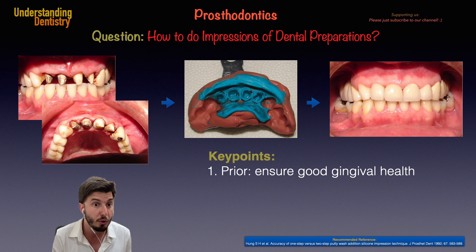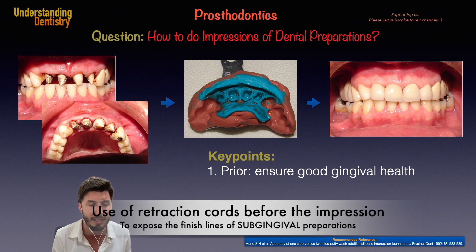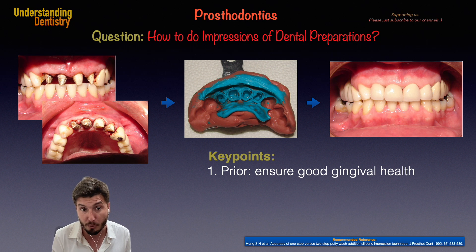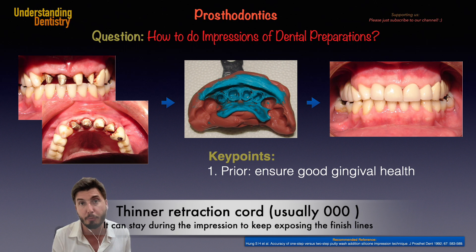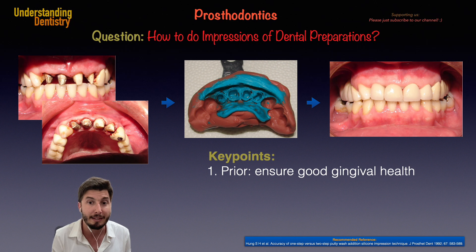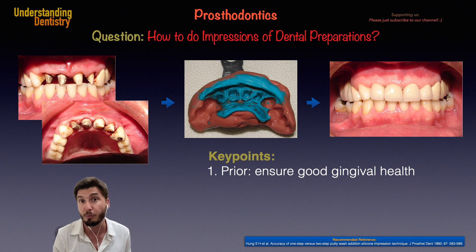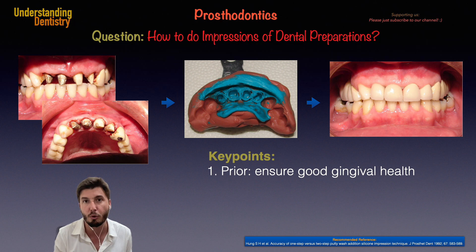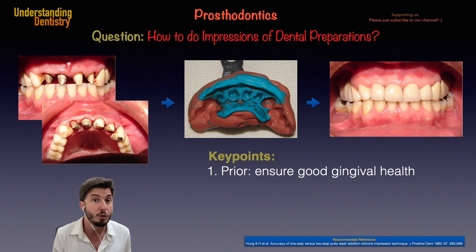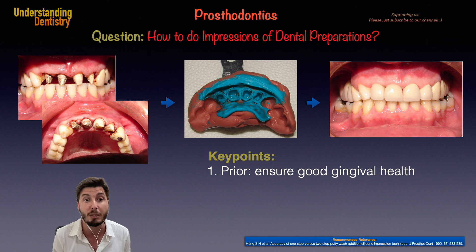We can also use other options to expose the border of the preparation. In this case, we use the two-cord technique. One cord stays exposing the border — the finish line of the preparation — and the other one, which is thicker, we remove before the impression. So the most superficial cord is removed, and only the deeper, thinner retraction cord stays during the impression. Sometimes it comes out with the impression, as you can see, and that's actually normal, because the preparation borders are still visible. The advantage of this one-stage method is that it saves time.